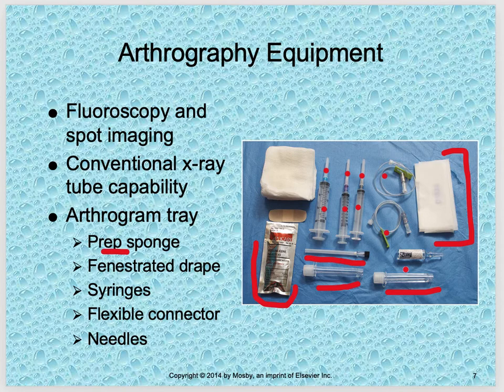And then this right here is the anesthetic that they'll use to deaden the area before they go ahead and introduce the contrast. And then also somewhere along the way you should have a bottle of contrast for the radiologist.